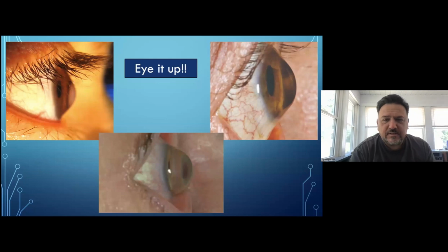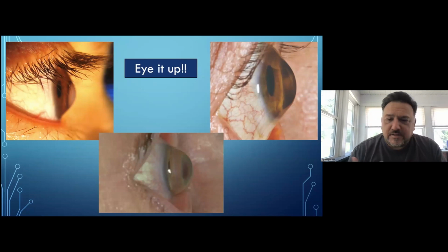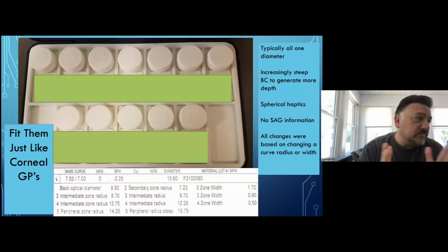And he looked at the eye and grabbed a lens and put it on, and he literally just eyed it up. And that side view of the eye gave them the information that they knew about how much depth they needed and what kind of shape they needed. And so, the old days of scleral lens fitting was literally just using your ability to look at an eye shape in side view from perspective, and understanding that, grab a lens from the set and put it on. And that was really some of the beginning points.